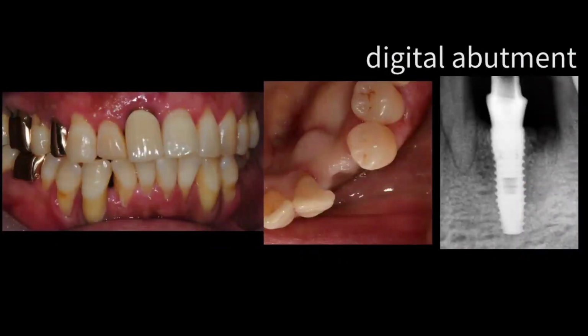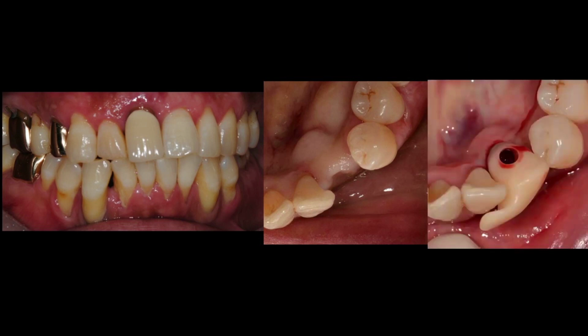With this case, the area in question is the number 33 and 43 sites. And this here is the photo of operation day. And you can see the wing on this, right? The wing. This is what is used when we put on the provisional.